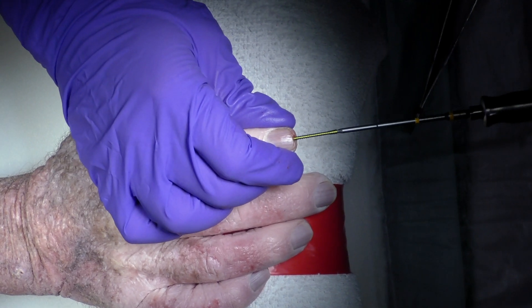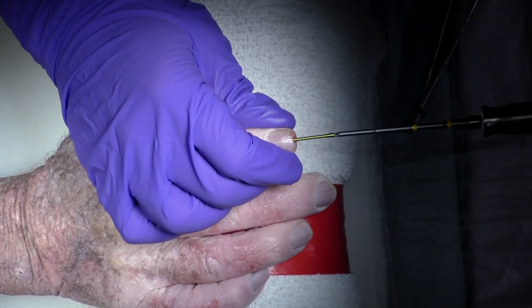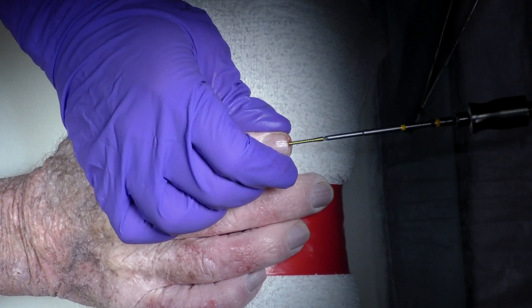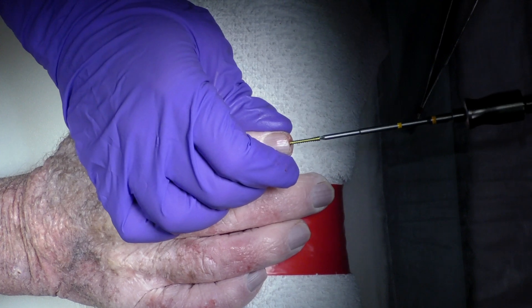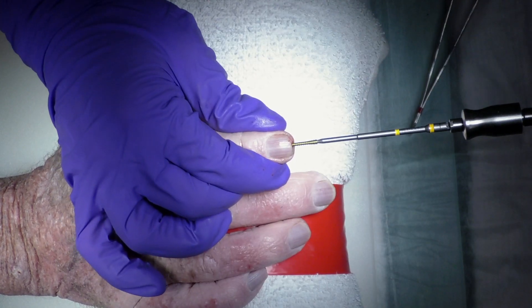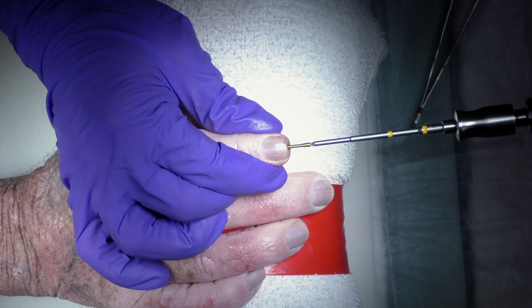Sometimes the distal phalanx can want to rotate with the screw as it engages, so holding the distal phalanx upright ensures that you don't give the patient a rotated finger. Then we'll check the depth and position of the screw under fluoroscopy.